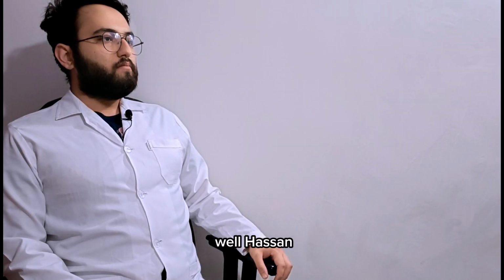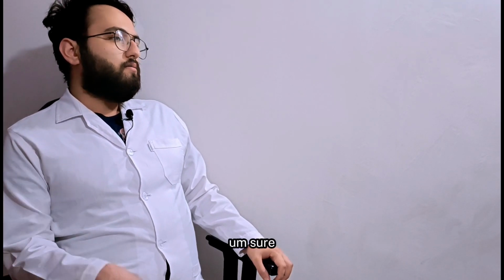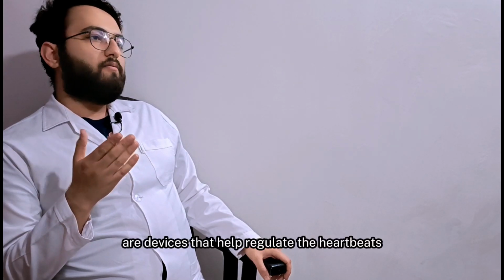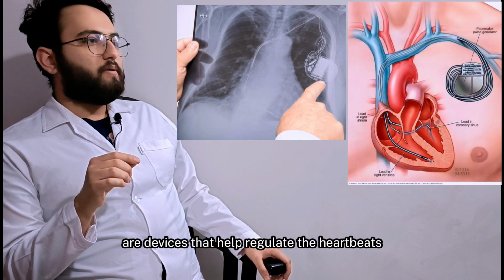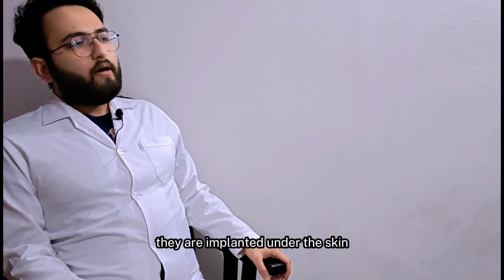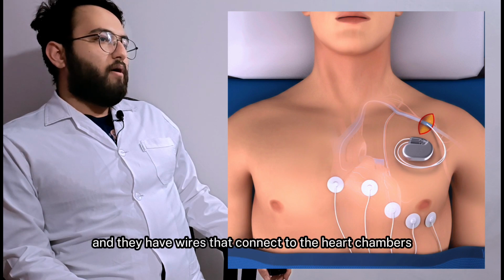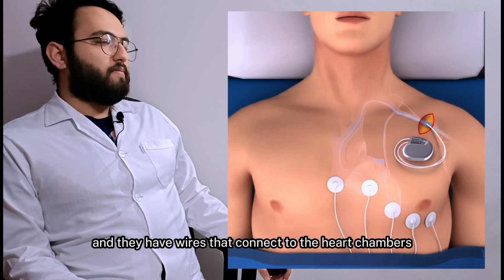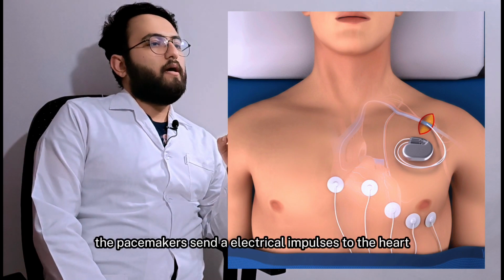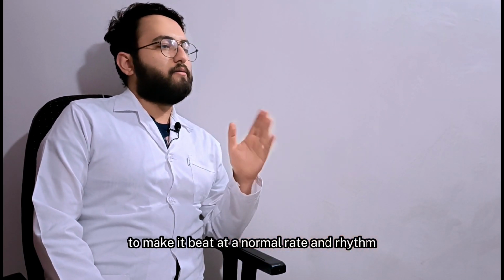Well, Hassan, would you like a brief explanation about this device? Sure. Pacemakers are devices that help regulate the heartbeats of people who have abnormal heart rhythms. They are implanted under the skin, usually near the collarbone, and they have wires that connect to the heart chambers. The pacemakers send electrical impulses to the heart to make it beat at a normal rate and rhythm.